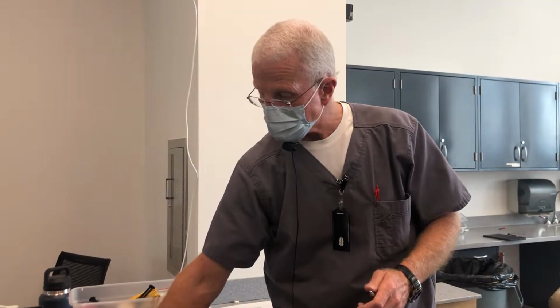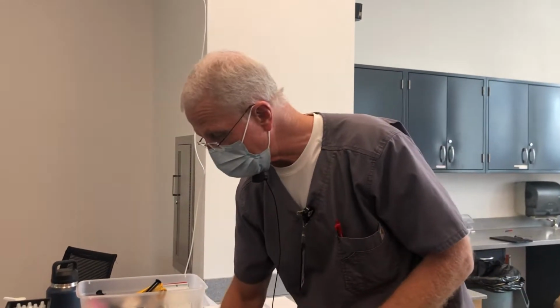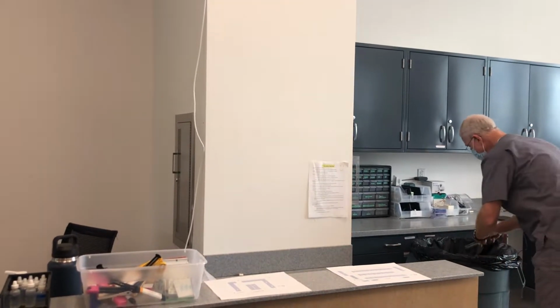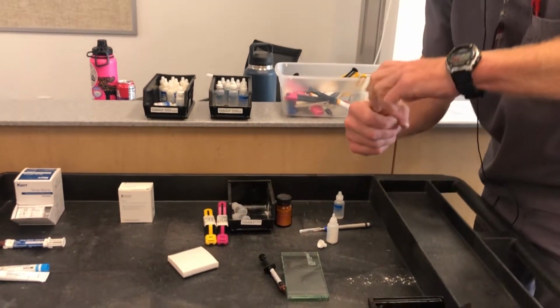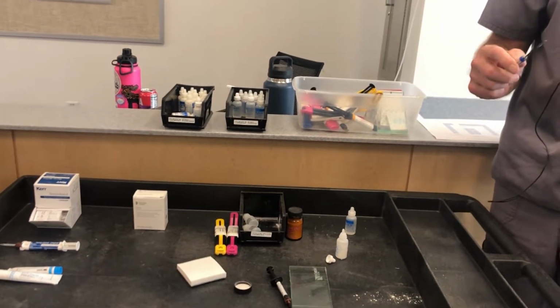So the zinc polycarboxylate is really nice because it's so easy to mix. You don't have to go through this long drawn out process like you do with zinc phosphate. You still want to mix it on a glass slab. With polycarboxylate, you'll use this occasionally in the clinic, not for a final cement, although that was its original intention.